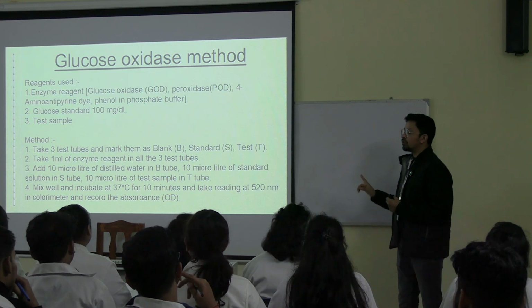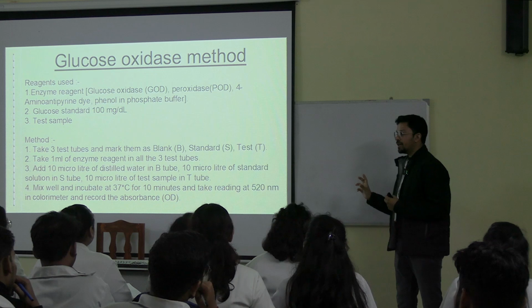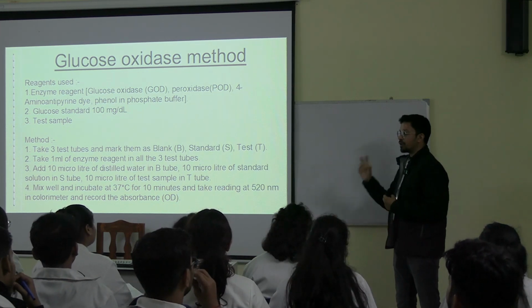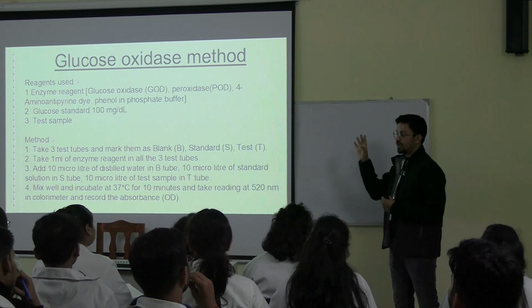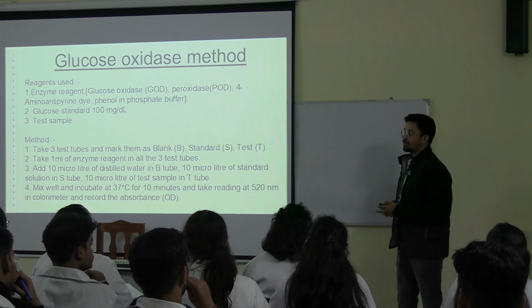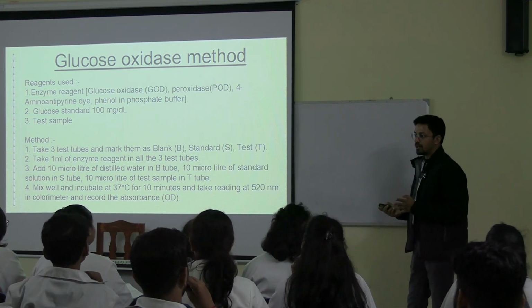This enzyme reagent and glucose standard both come as a kit. You open the kit, you see it, and that is how it is written over there. What the compositions are is written over there, and the functions of the compositions I'll come to. And the test sample is also there. That is the sample with glucose concentration you don't know, the unknown sample.